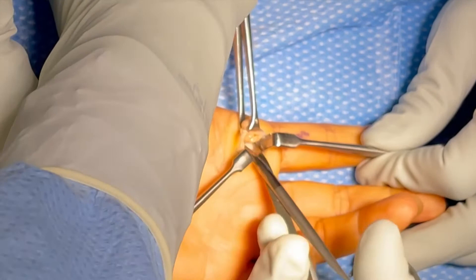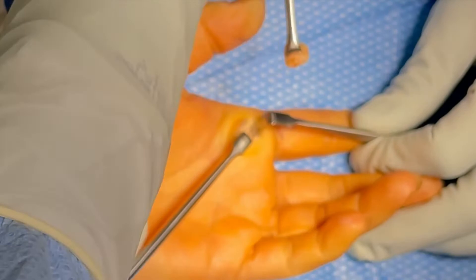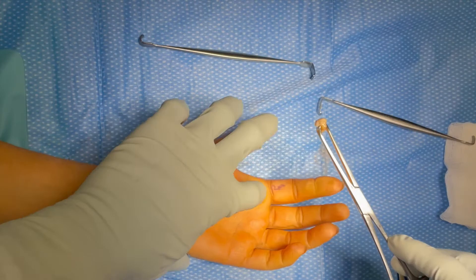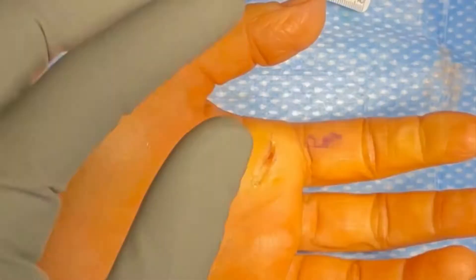In this case you'll see me separate it and the mass will come out here in one large piece. We'll then be able to measure it. The tumor measures right around eight millimeters in diameter, which felt like a relatively large mass for this area of the hand.